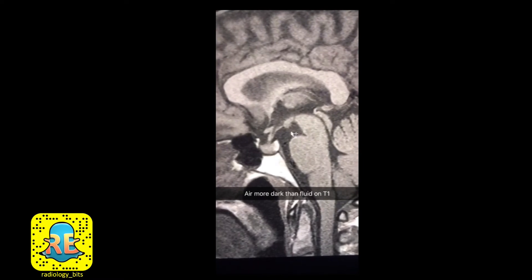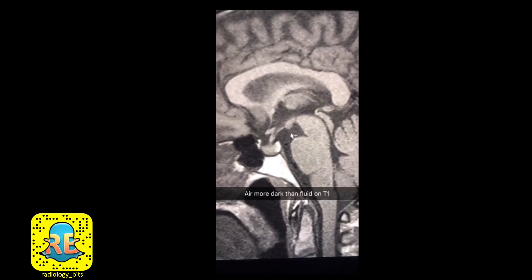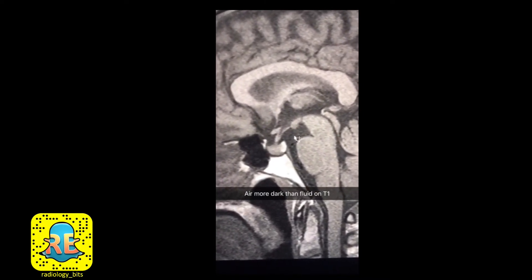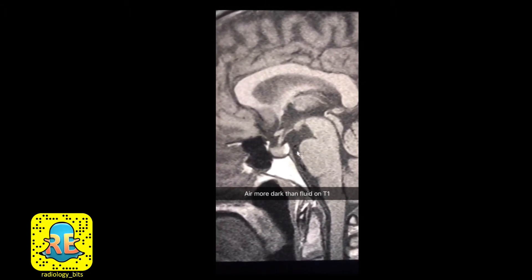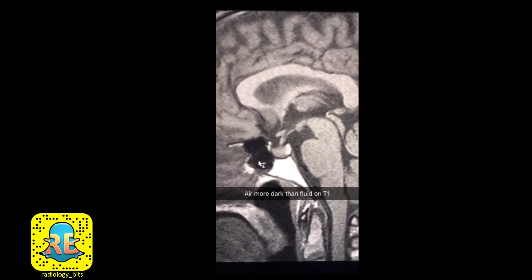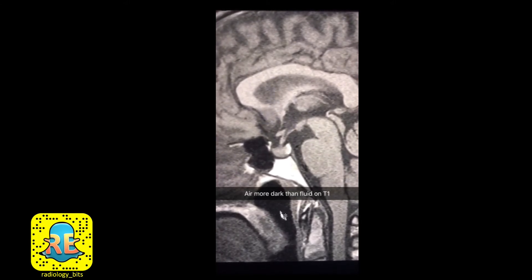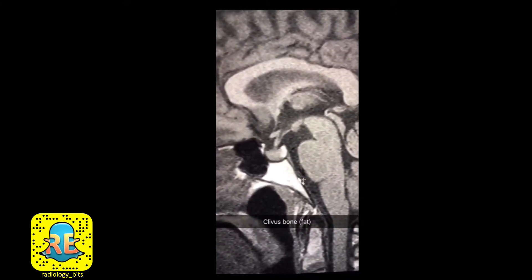As we agreed, fluid is black on this T1 MRI image. CSF looks black, but keep in mind that what's even darker than fluid or CSF is air — such as the air you see here in the sphenoid sinus or the air you see here in the nasopharynx.